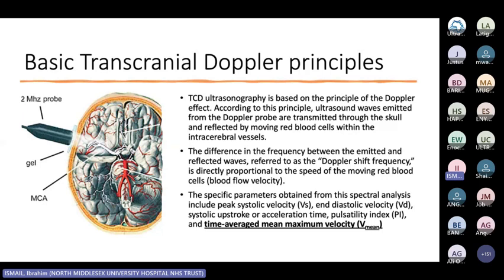I'll go through this, not in that much depth, but I believe many of our colleagues have performed this already, but it's good to just have an overview as well. So TCD ultrasonography is based on the principles of the Doppler effect.